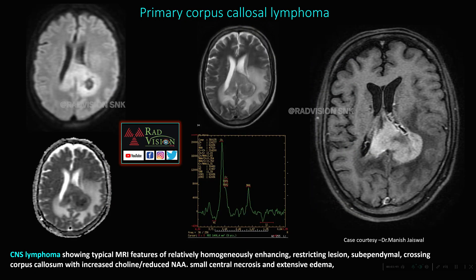CNS lymphomas are close differentials for glioblastoma multiforme. Here there is a hyperintense lesion in the splenium of corpus callosum with pericallosal extension, showing restricted diffusion on DWI with low ADC values, iso to hypointense on T2-weighted imaging, and intense homogeneous enhancement after contrast with only few areas of necrosis. This is primary corpus callosal lymphoma in an immunocompetent patient, with elevated choline peak and reduced NAA. It typically shows subependymal spread and restricted diffusion with low ADC values.